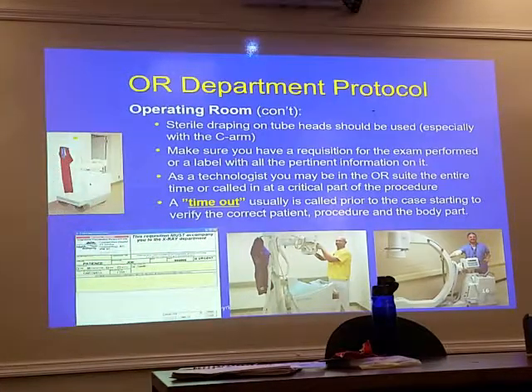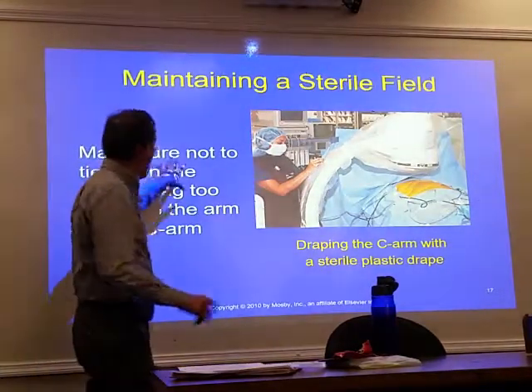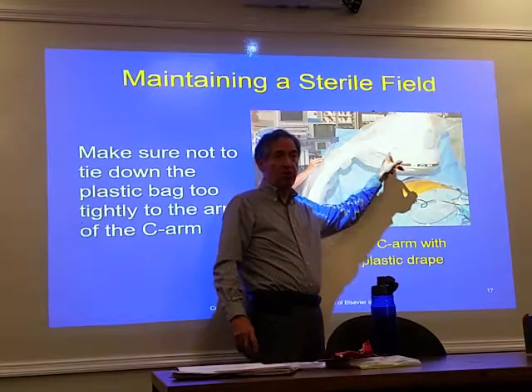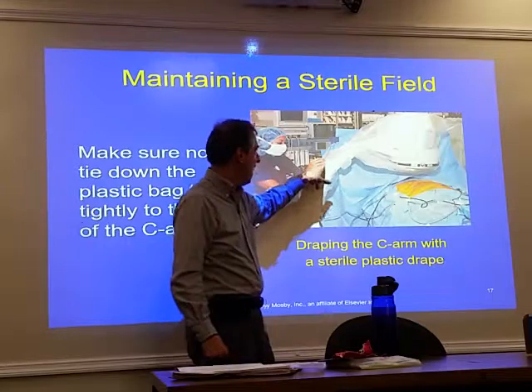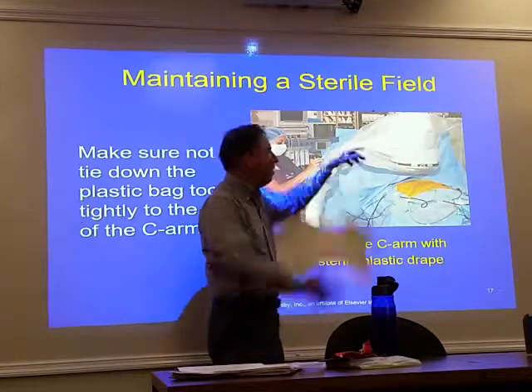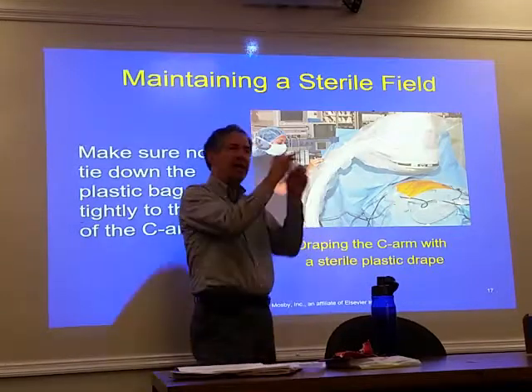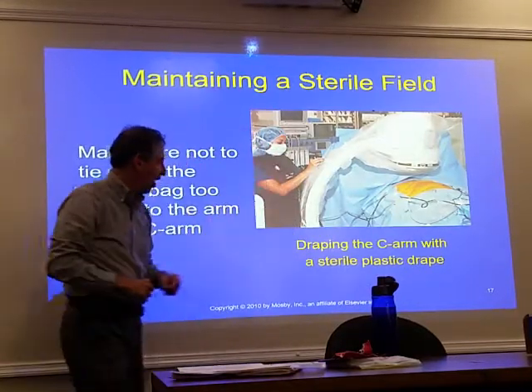Okay, so let's go on to this here. This is just a suggestion. Whenever anyone has put on these sterile drapes on the top, make sure they don't tie it. You can certainly touch this with your hands. Don't tie this too tight, because when you turn it into the cross-table lateral, it can really stick in terms of going down into the unit, so be real careful.